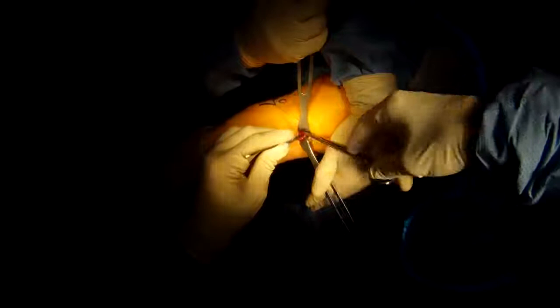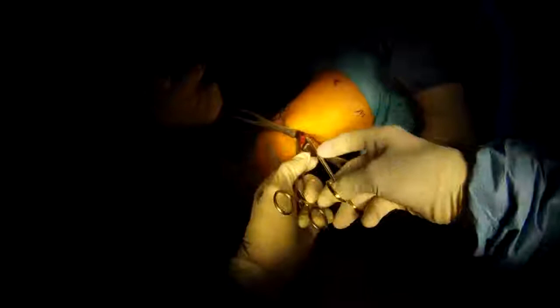Now once I have the ulnar nerve free, things get easier. Now I'm grabbing the joint capsule that I'm going to cut and do this openly because I already have to make a small open incision for the endoscopic. And I get a grabbing device called a coker on the capsule.